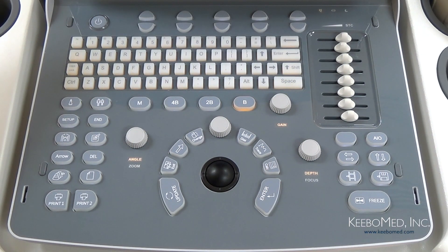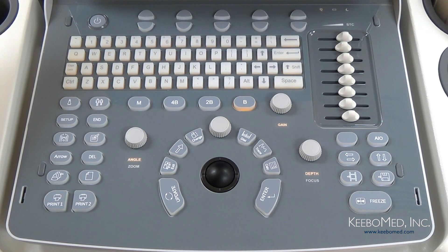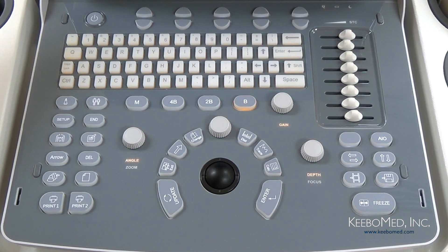Let's take a look at the keyboard layout. The keyboard is set up to allow quick and easy use. The majority of the keys are one-touch keys that simplify the operation and save time.